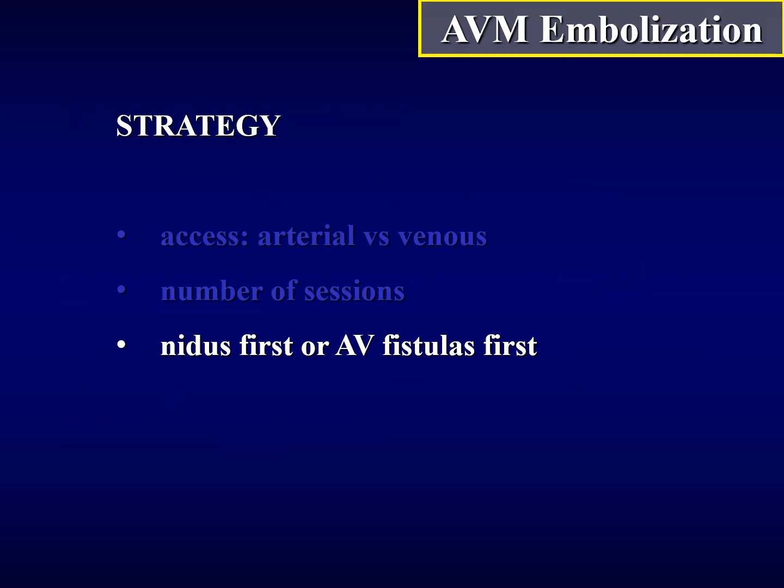If you want to discuss the question, should I attack the AV fistulas first or go to the nidus first and keep the big shunts for later? Well, this is a nice question, but I think that so far there is no real agreement. Most people just go to the fistulas because that's easier and they think it's better, but again, this is not for sure.